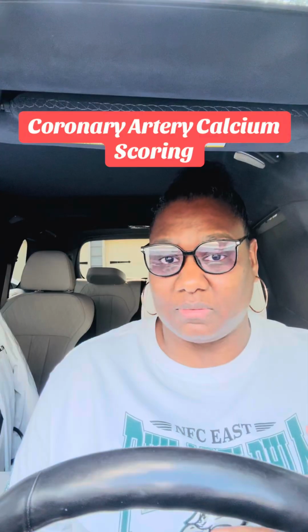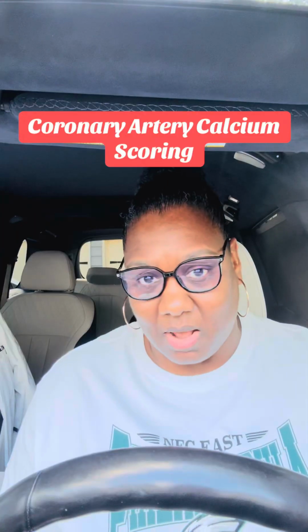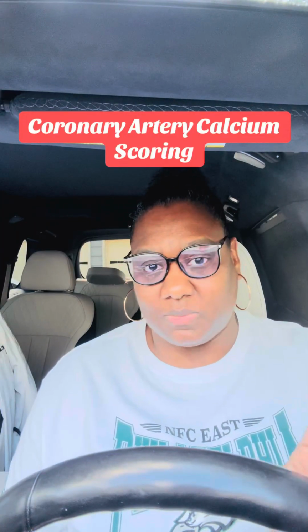Because we want the heart rate to be at or below 65 to 70 beats per minute. You don't want the heart racing or beating too fast that the images from the CAT scan can't capture good pictures. The heart rate doesn't have to be in the basement, not at all, but it can't be like 90, 100 beats per minute. That's way too much motion and activity for the CAT scan to get good, clear pictures.